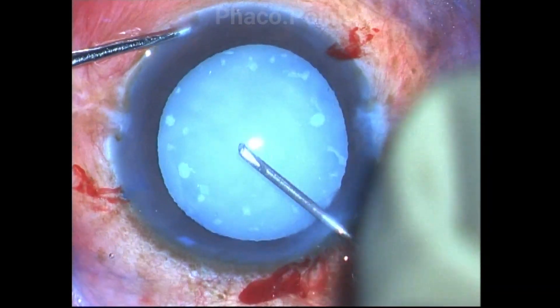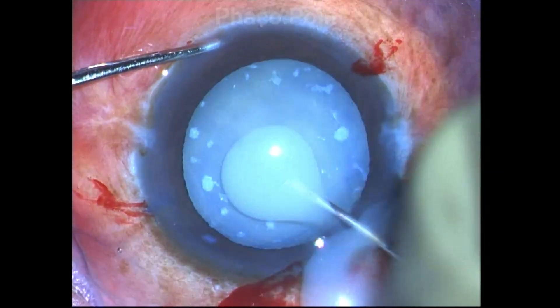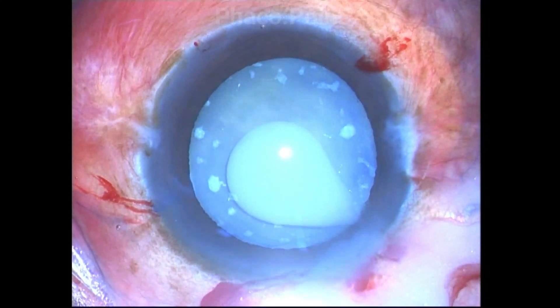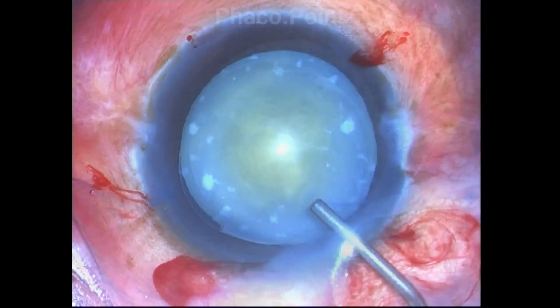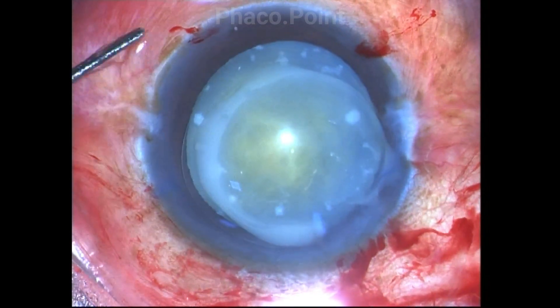This is not an intumescent cataract. It's a cataract in which the cortex is completely liquefied and we do not have to use cohesive viscoelastics — simple methylcellulose will do. So after puncturing the capsule, it's important to clear up the area of the liquid cortex by injecting viscoelastic.